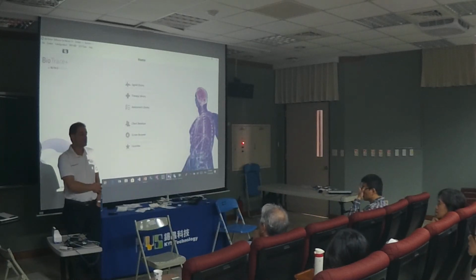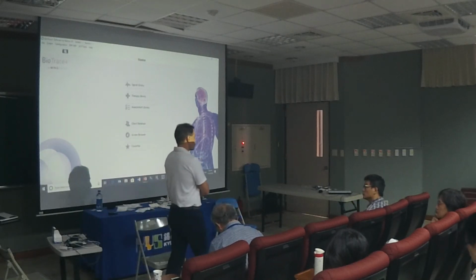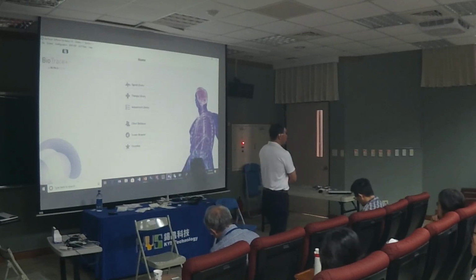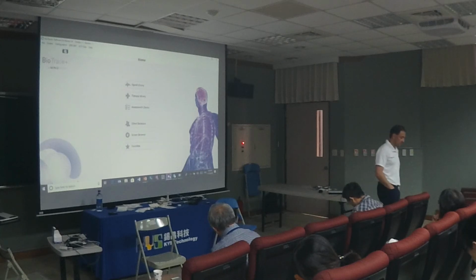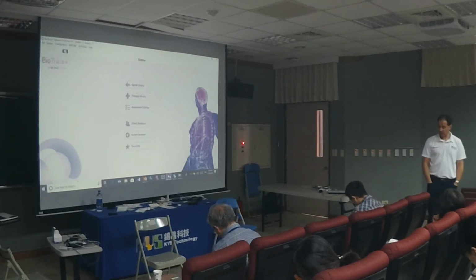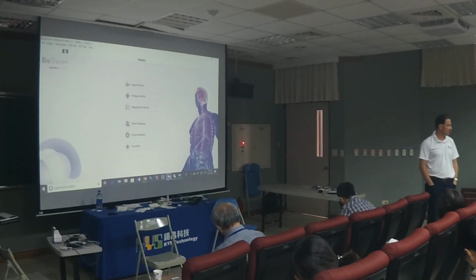Okay. Now, during the session, you're gonna have to make decisions about how to train the client. Do you use audio training? Do you use video training? Do you use music training? What do you use? I say use all of them. I say use them in combination. Sometimes the training needs to be a little boring. Sometimes it needs to be a little entertaining. I don't recommend using movies all the time, because then the client gets too caught up in the movie, and that can be overstimulating.